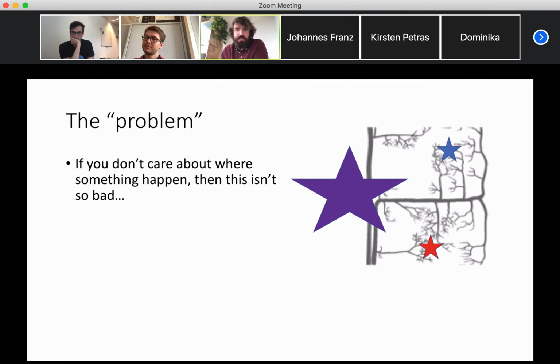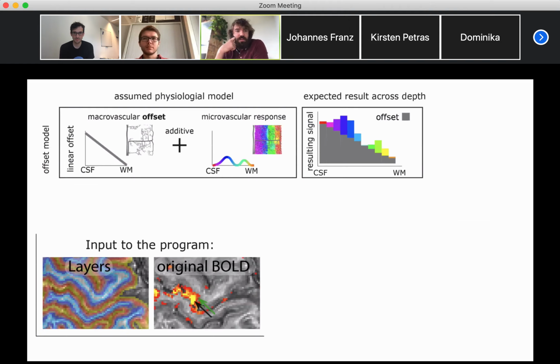Renzo's blog presents 3 ideas with approaches for them, and I'll talk about another one developed by Kendrick Kay. The first one is what Renzo calls the offset model. I like this one because it's very simple, and it kind of looks like the data to me. If we look at the left panel, we have this linear offset. Note that these axes are reversed from the graphs that Renzo helped us produce a few weeks ago. So CSF is on the left.